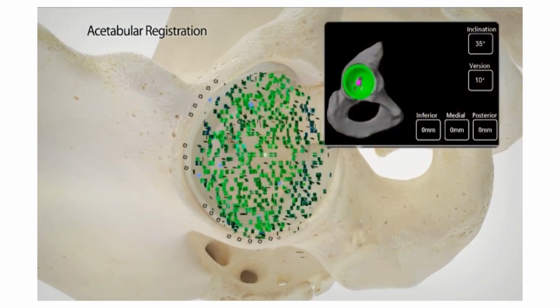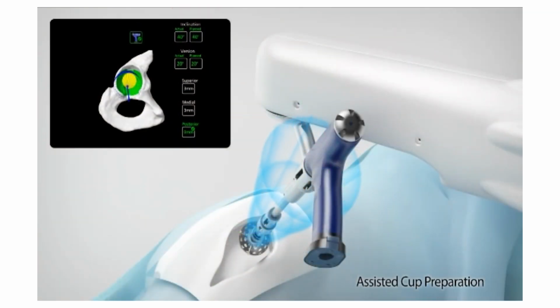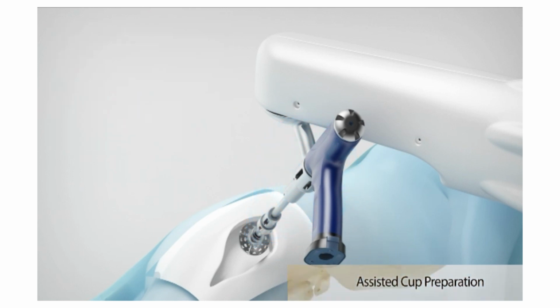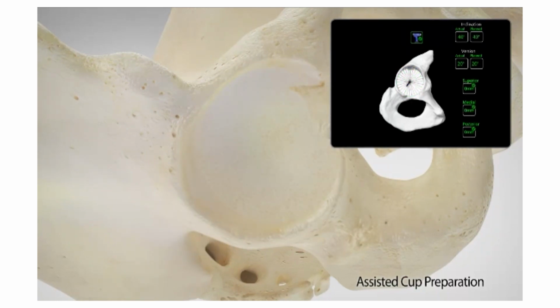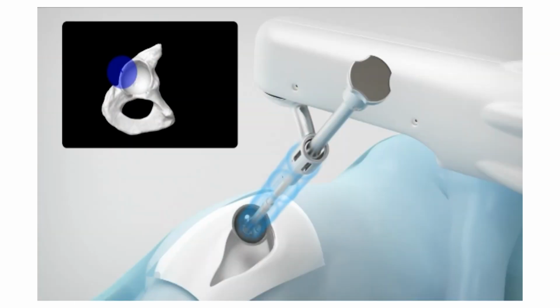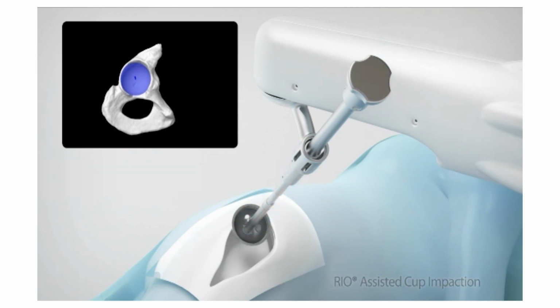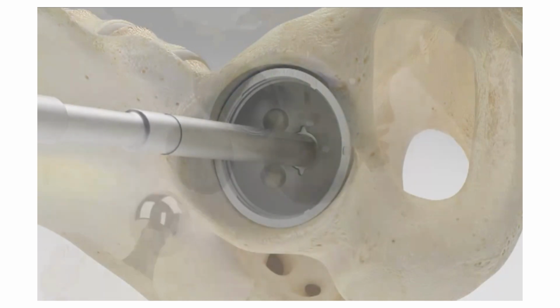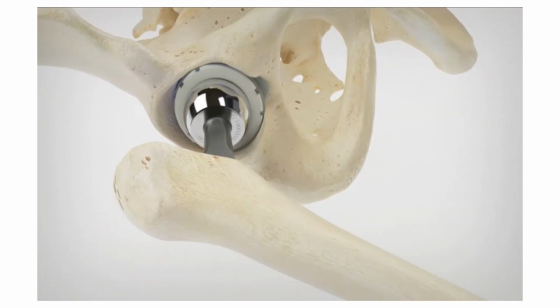Similarly, on the cup side or the acetabular side, we tell the robot exactly where the patient's anatomy is. Once that's correlated with our plan, the robotic arm is brought in and it knows what our plan was, and this is basically a computer-aided design manufacture kind of philosophy where when we hit the trigger, and again, I'm still hitting the trigger, we resect the exact amount of bone that we preoperatively wanted to. Then the robotic arm is brought back into the field and we can implant the cup in exactly the right anteversion and inclination within a millimeter and degree, so that we're not pushing that cup into the pelvis like the previous example. Then we put everything in the cup and the socket in place.